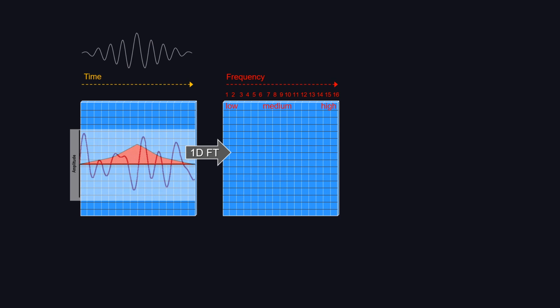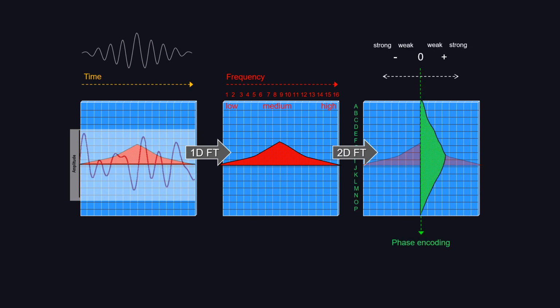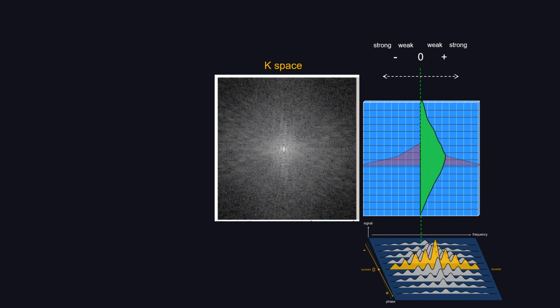Now we can localize the signal based on its unique frequency in each column. Then we perform phase encoding steps in the y-axis and Fourier transform. We can now identify the signal based on its unique phase in each row. So different frequencies in different columns and different phases in different rows.